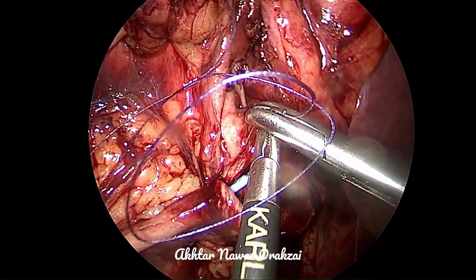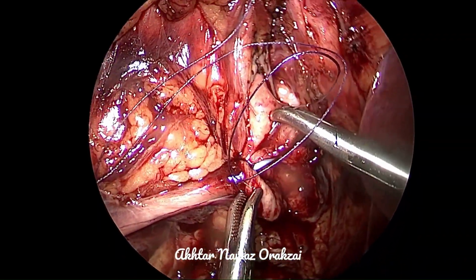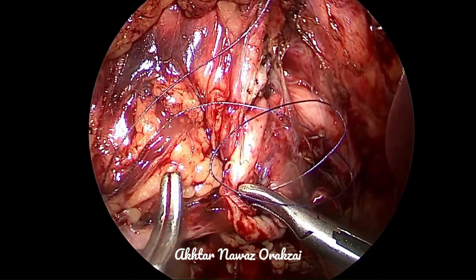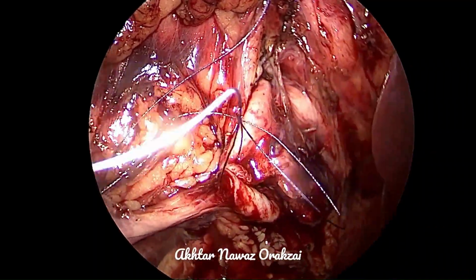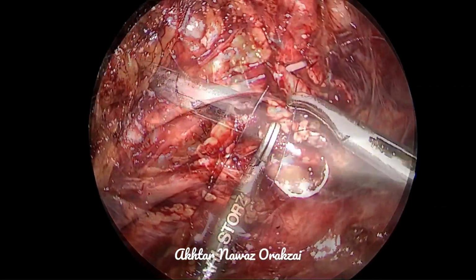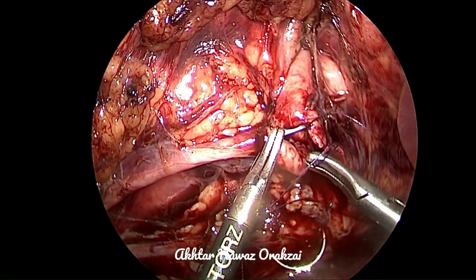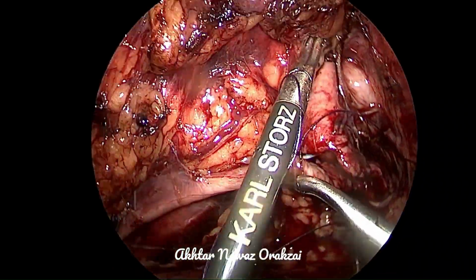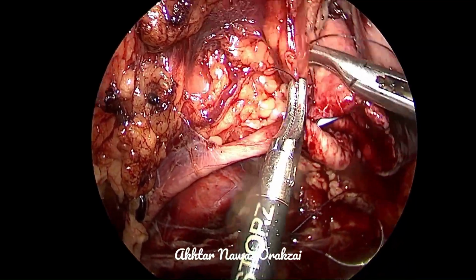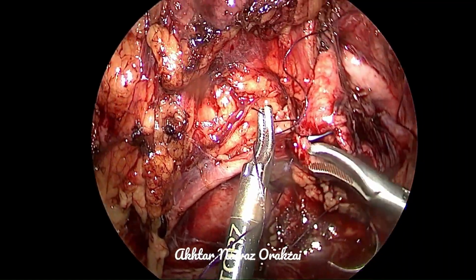Now we begin the other wall. So, speaking of the anastomosis, I prefer continuous suturing because it is good for the anastomosis to be watertight.